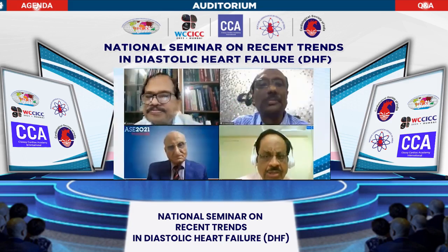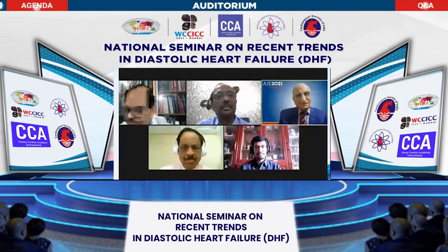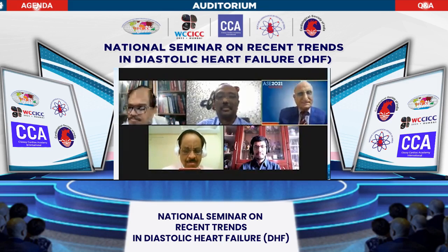Sir, in your wonderful 40 to 50-year experience, how often is it that you require an additional investigation apart from echo, sir? Just wanted your take. Although we usually go by the signs, very rarely have we undergone an invasive study. But sometimes we have taken the help of a CT to look for pericardial calcification.